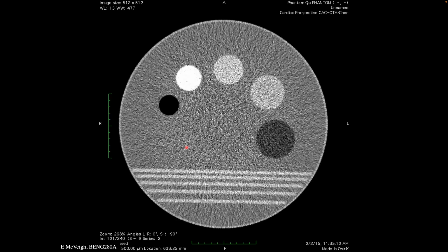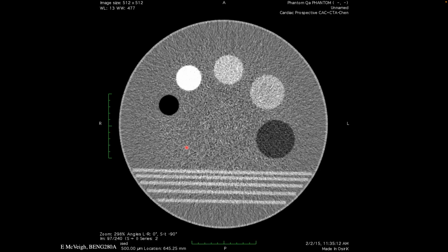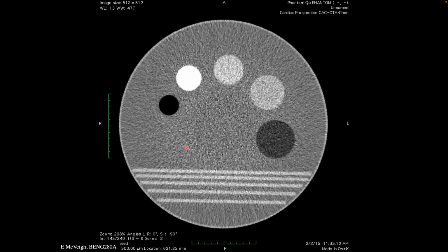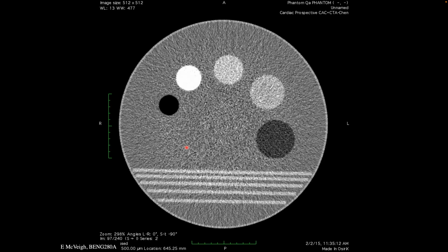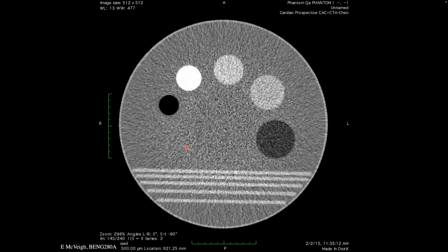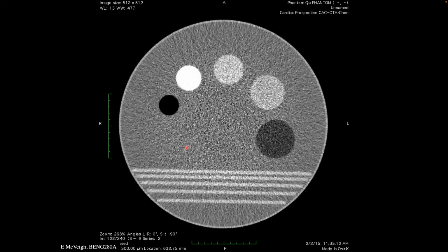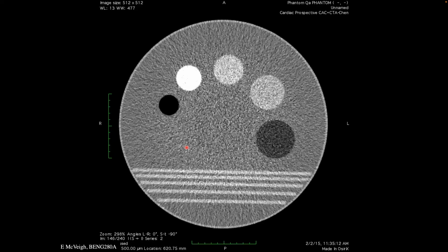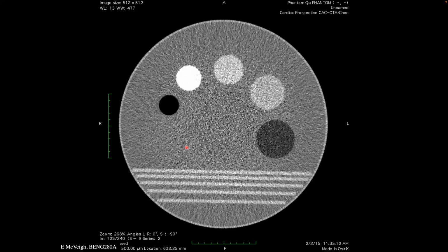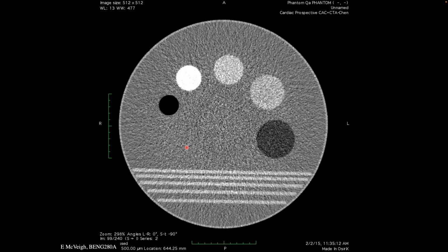That's for averaging. So you take a bunch of the same slice, average over and over. No, that's a really good question. In CT, does anyone ever do temporal averaging? That is, if my noise is high, why don't I just take 2 acquisitions and average them together? And then my noise would go down by √2. The reason is because when you took your first acquisition, the equivalent way of doing that is just to turn up the mA. So why not do that?